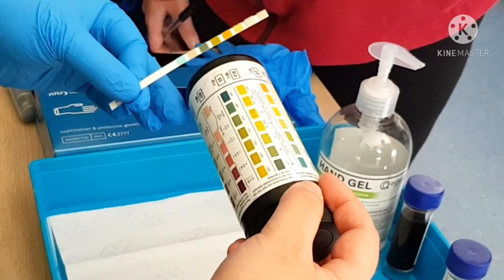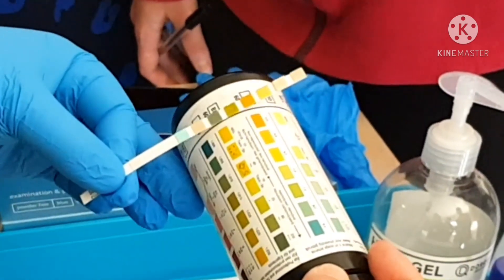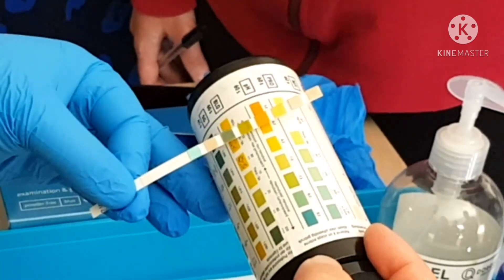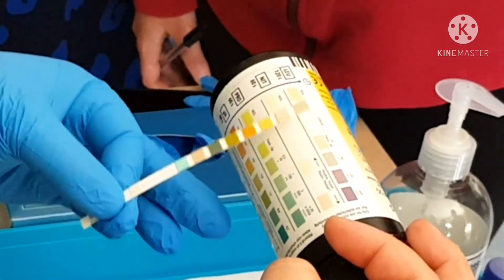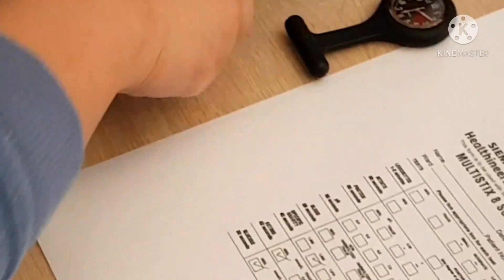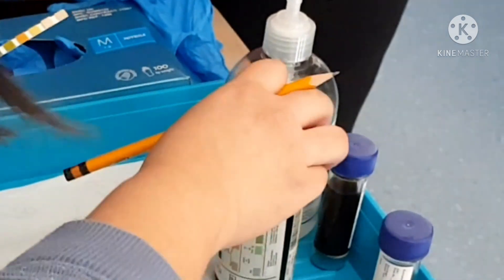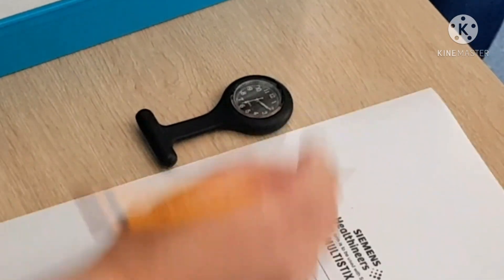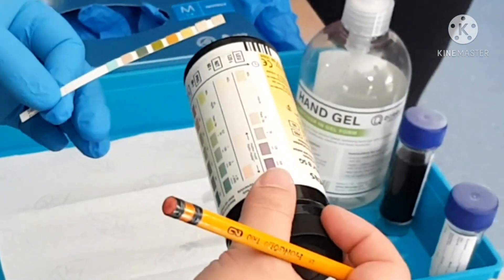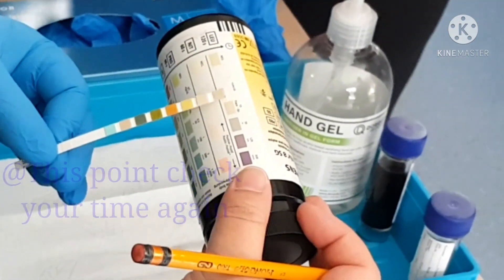The patient's blood is 25 plus, and then the pH is closer to 6, and then the protein is negative, and then the nitrites is closer to negative. So the blood was 25 plus, the pH was 6, nitrites was negative, and then my leukocytes — since it's already been 2 minutes or 120 seconds — is actually closer to trace.